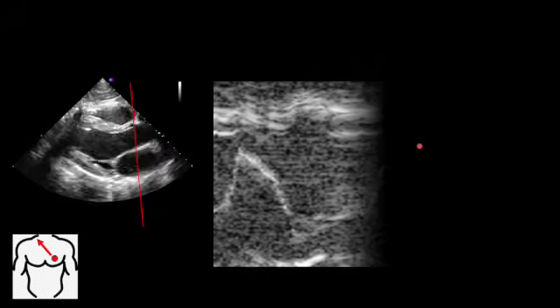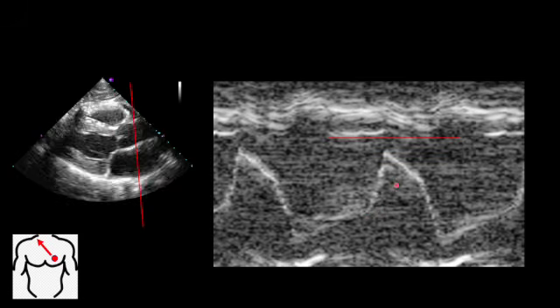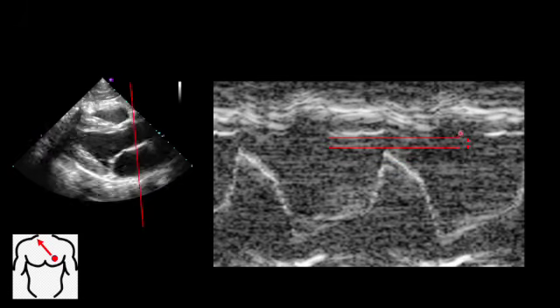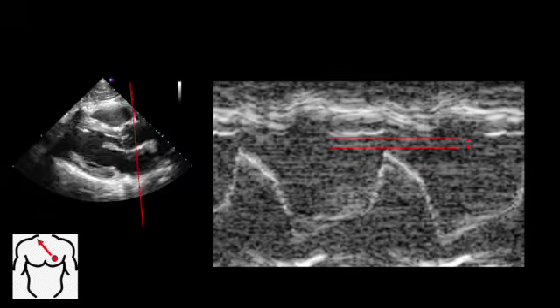So let's say we trace out an M-mode measurement over time. This line is in the wrong place. Pretend it's over that anterior leaflet of the mitral valve. What we could do is take a measurement between the endocardium of the interventricular septum and the E point. And the distance between these is our E point septal separation. So you just drop your little cursor on there and you measure this distance.